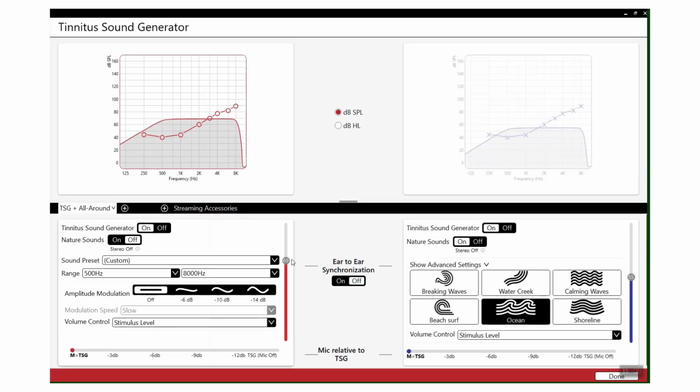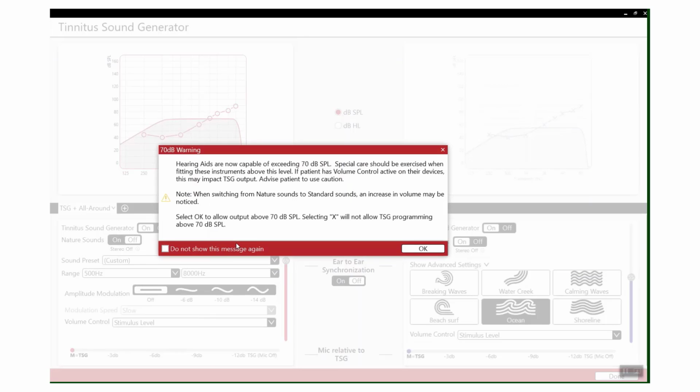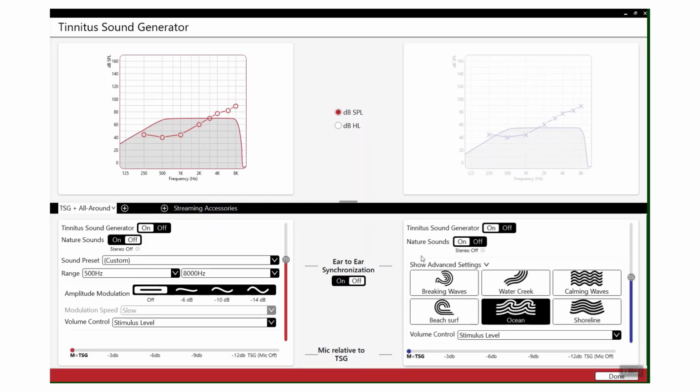You can increase the intensity. You will get a warning when you go above 70, which you can click OK. If you do need to prescribe above, just do so with caution. You can increase the mic relative to the tinnitus sound generator, so you can reduce the amount of input coming from the mics and increase the amount of input coming from the tinnitus sound generator. And you can also manipulate the volume control, so you can have stimulus level or stimulus level plus environmental steering.